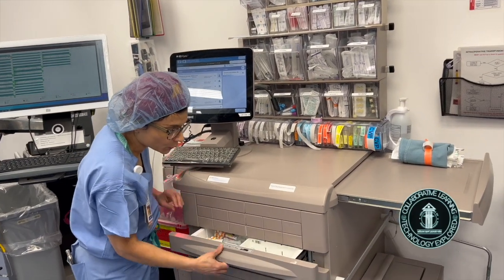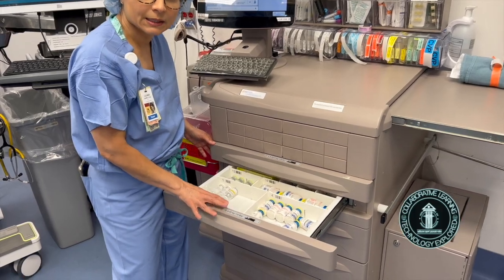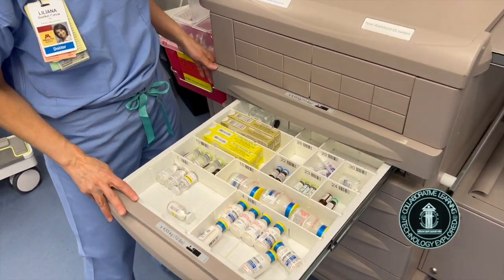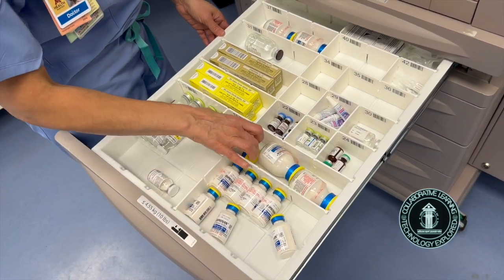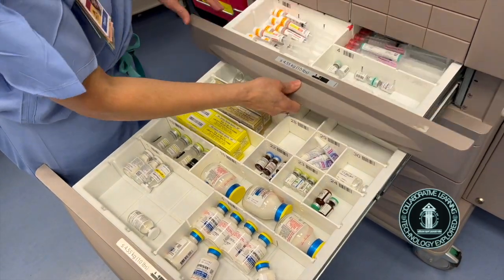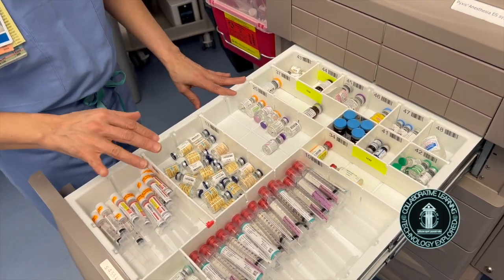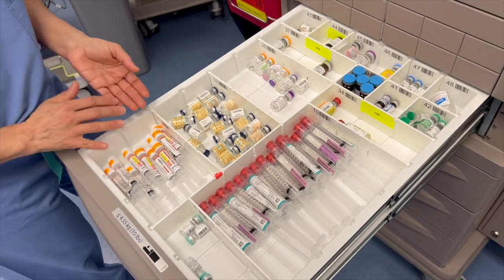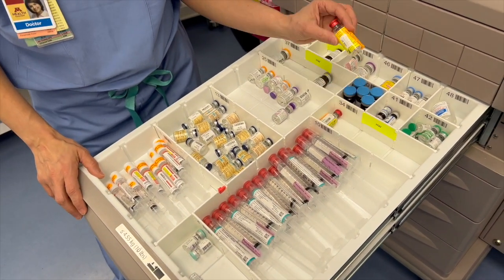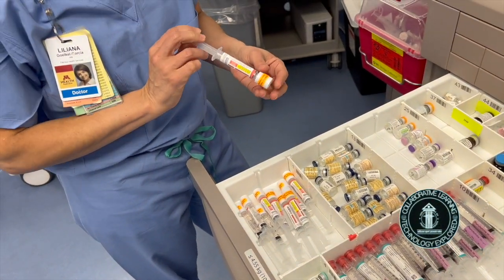On the top two drawers, we have the most commonly used medications that are needed for induction of general anesthesia. For example, I have different vial sizes of propofol. I will have etomidate in this drawer. I will have also lidocaine. I will have some of the most commonly used neuromuscular blockers. I have succinylcholine here. I have rocuronium already pre-packed.